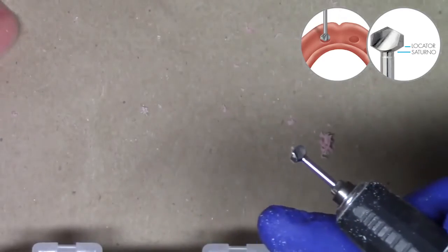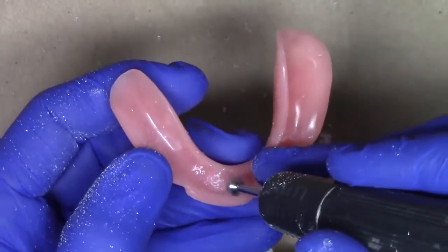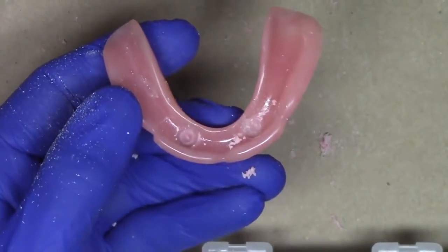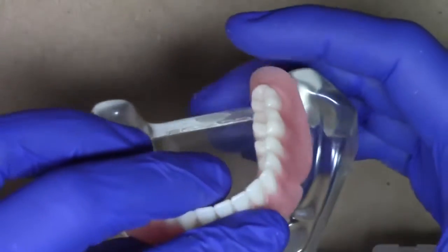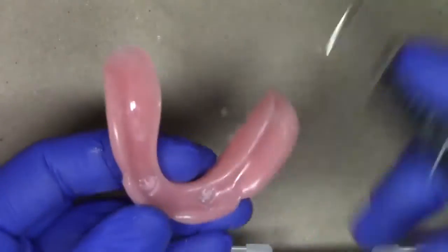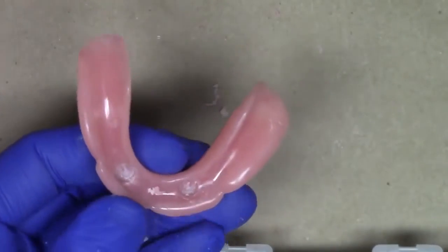If I go further, sinking the burr all the way into the denture, that corresponds to our Saturno attachment. I'm going to repeat that for the other side, cleaning off some of that space and using air. Now I can try this back onto my existing complete denture onto my ridge. I notice just a little bit of rock, so I'll have to go a little bit further. There we go — and to the other side. Perfect.